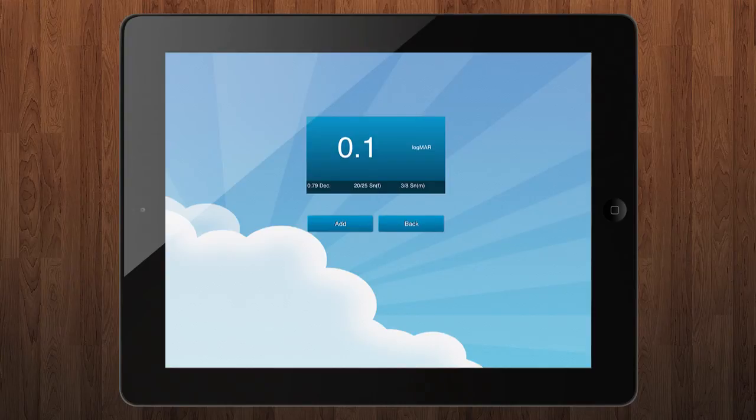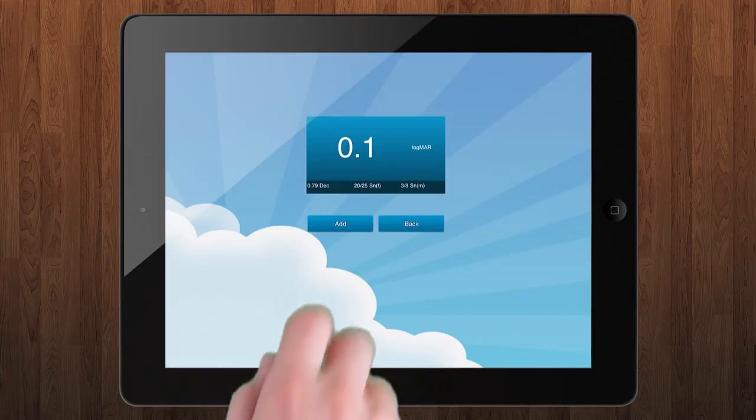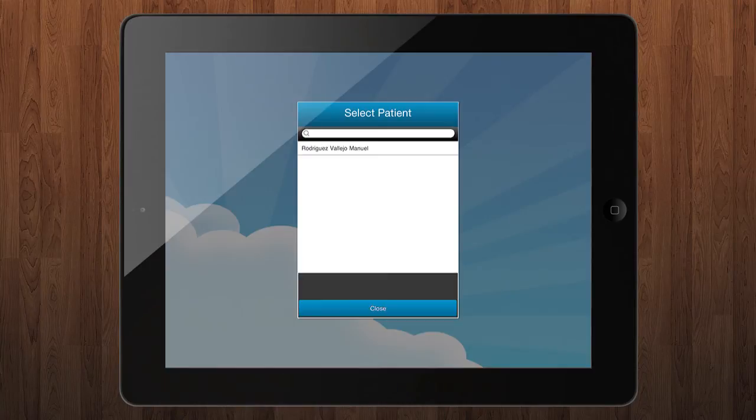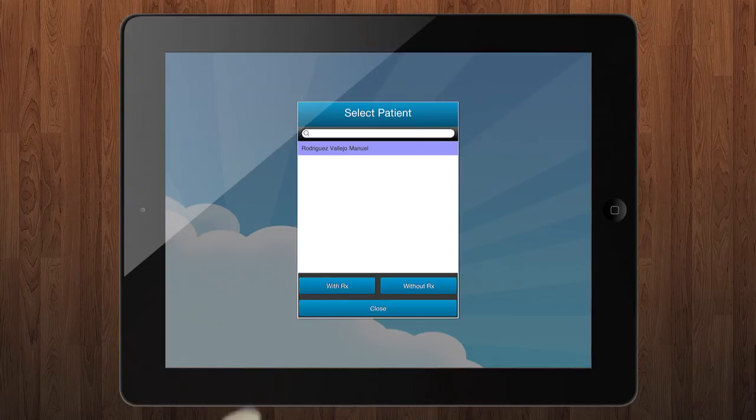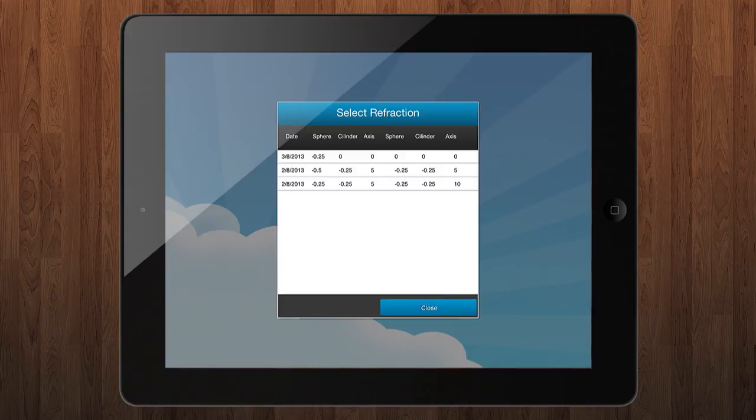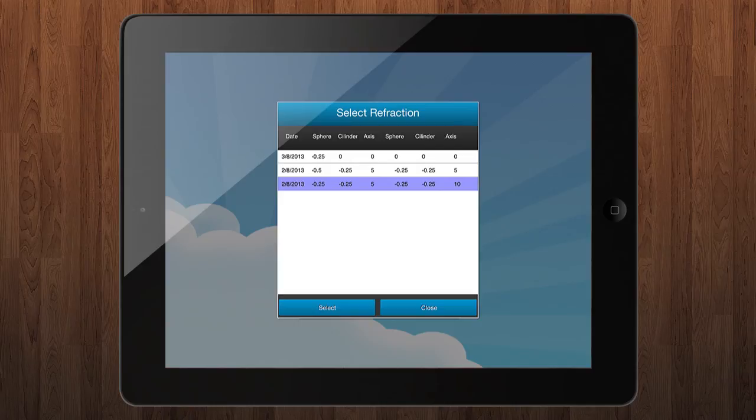Here you can add this result to a patient by pressing on add button. Select the patient and save with or without refraction. If the exam has been done with patient compensation, select the proper refraction that you have added before starting the test.